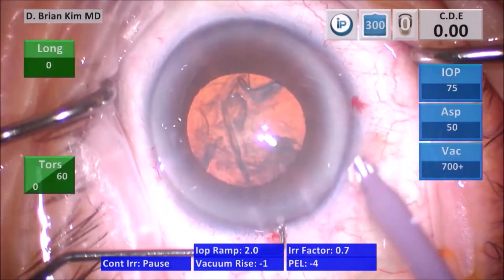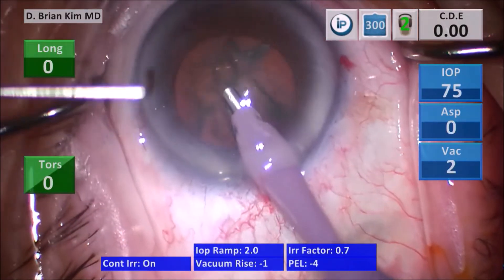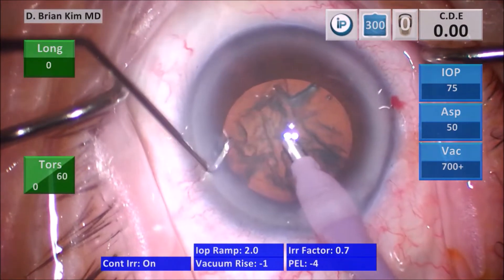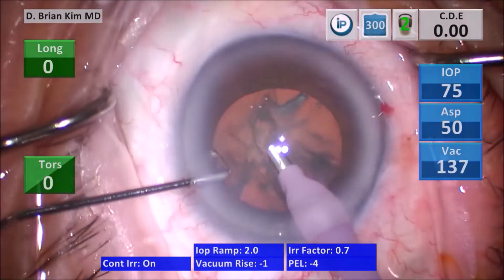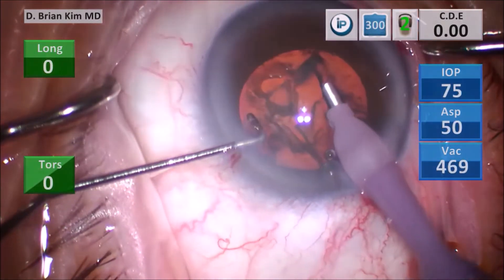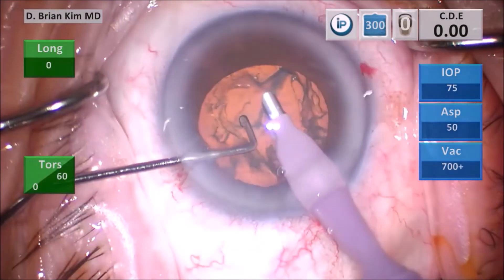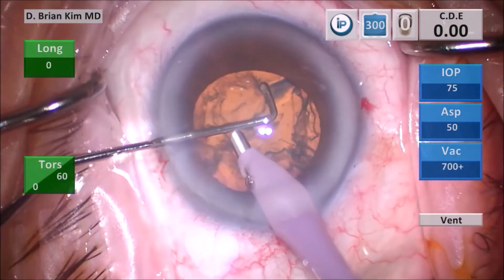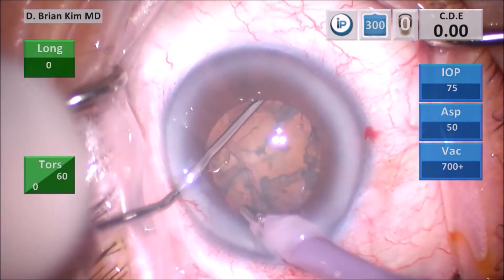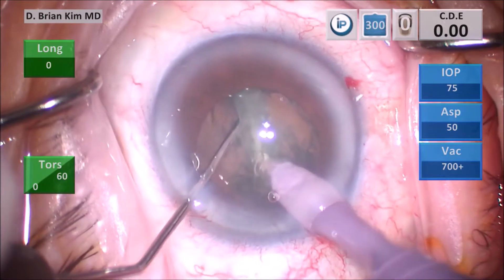I lift my corneal incision with my chopper and go into the eye with the phaco tip without irrigation to minimize incisional trauma. I remove the surface epinuclear material — by removing it, I can see that step off and go underneath the epinucleus with confidence, making sure I'm definitely in the bag. I place the chopper out to the equator, turn the phaco tip more vertically, and crush the lens piece meeting in the middle, which divides the lens completely in half.